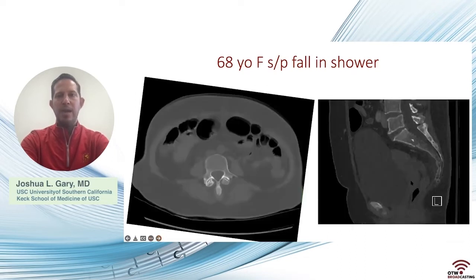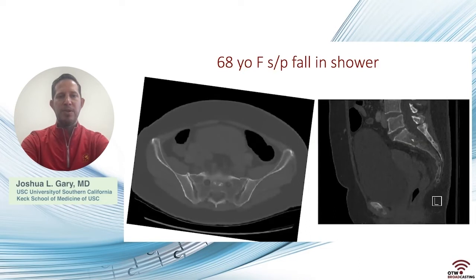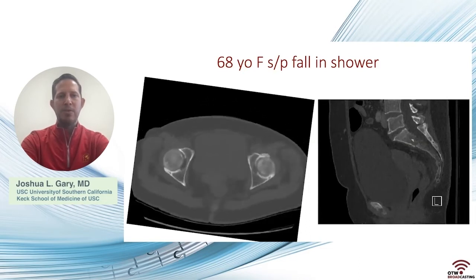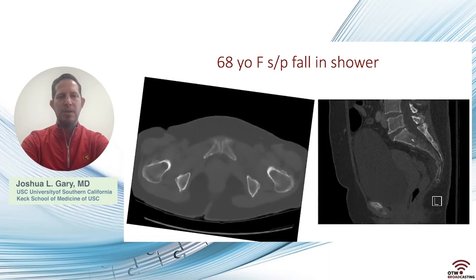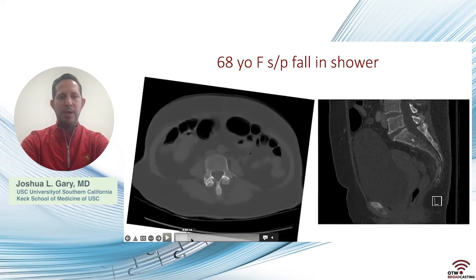And so we got a CT scan like we do for most of these injuries to help identify the injury. She had pain posteriorly and some in the front. And when you look at her axial CT cuts, as you come down, you see some arthrosis in her spine, but really, you don't see much, and we'll go back through this in her sacrum. It's hard to see. And then she's got some non-displaced fractures in the front of her ring as well.